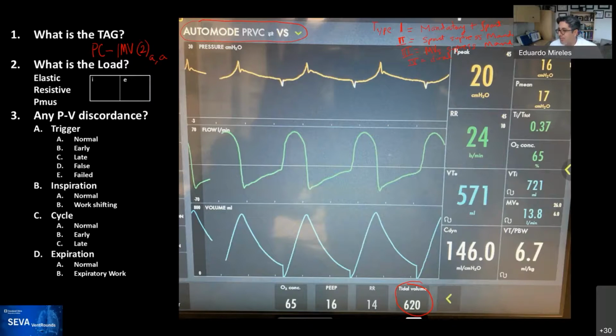And for 3, it actually depends, Robin. You can probably talk more about this, because it's the Draeger mandatory minute ventilation, right? It has to do with the spontaneous breathing, and then it combines mandatory breaths with spontaneous until you achieve your target goal. Yeah, right. Obviously, there has to be some sort of running average for minute ventilation.